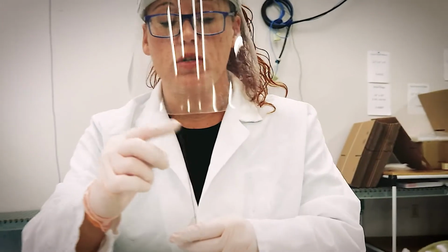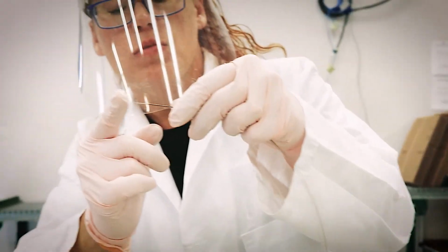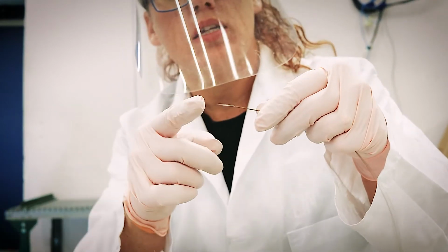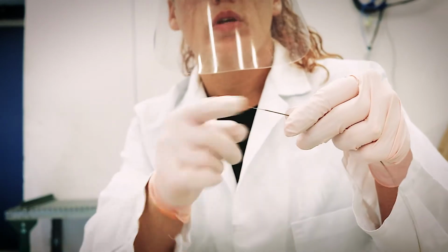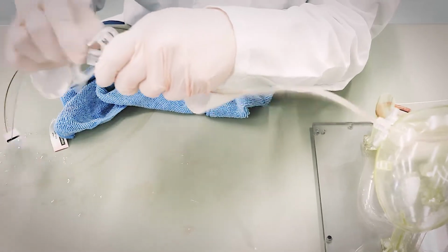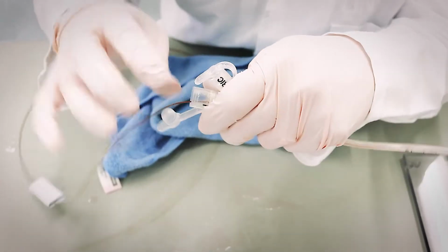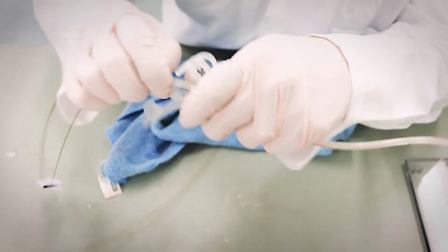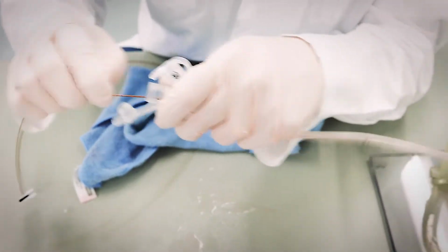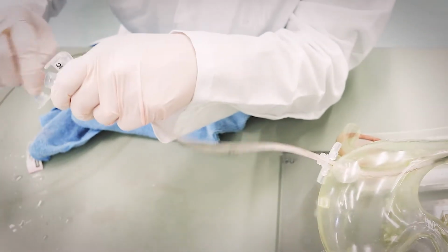Also, always remember to stop and check that when your control box is on, you can still see the end of this moving back and forth, letting you know that you did not kink it and it's still got good displacement. So it's also inside there working on that clog. I like to alternate between really fast and really slow, but still keeping that distance short. And sometimes I'll hold a little push to help it go forward.